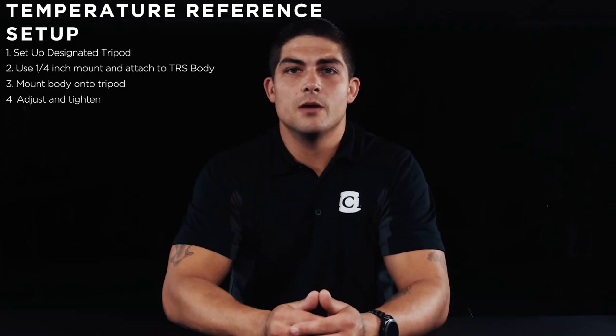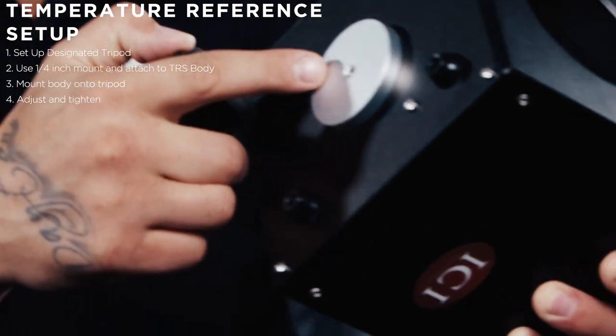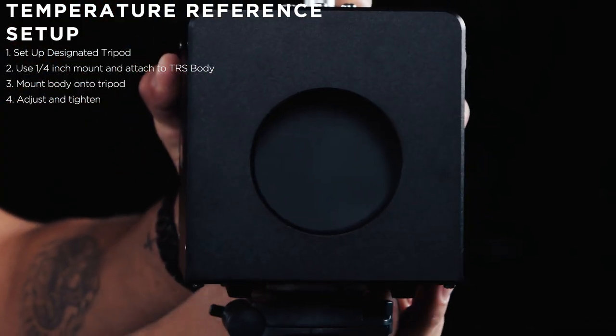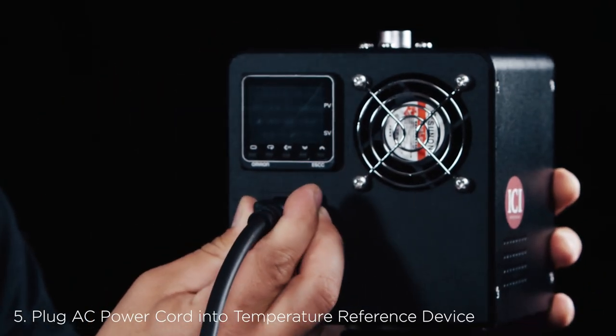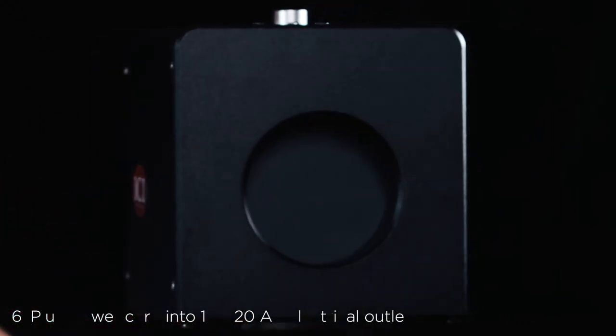Since we have already set up the tripods, we are going to mount the temperature reference device to the dedicated tripod using the center quarter-20 mount on the bottom of the temperature reference device. Plug the temperature reference AC power cord into the temperature reference device and then into a surge-protected 110–120 AC electrical outlet.